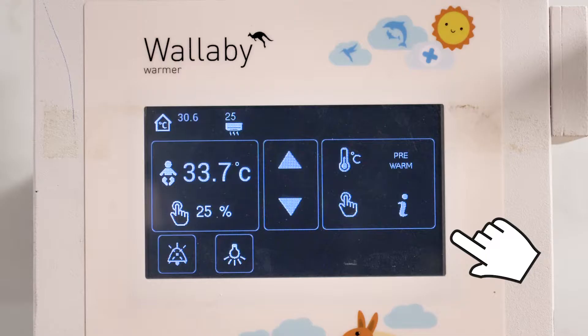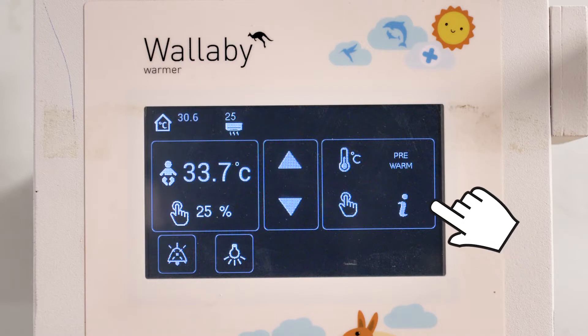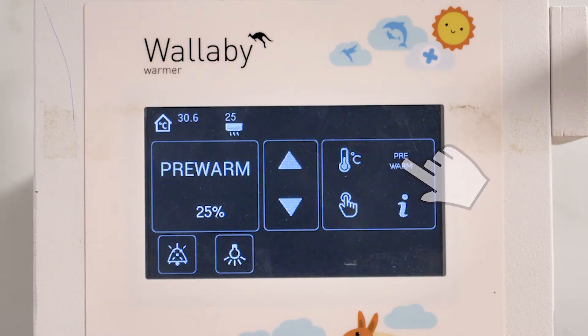On the Wallaby radiant warmer, warming the cot is even simpler. You simply put it into pre-warm mode. This turns the radiant warmer on at 25% output for 10 minutes.